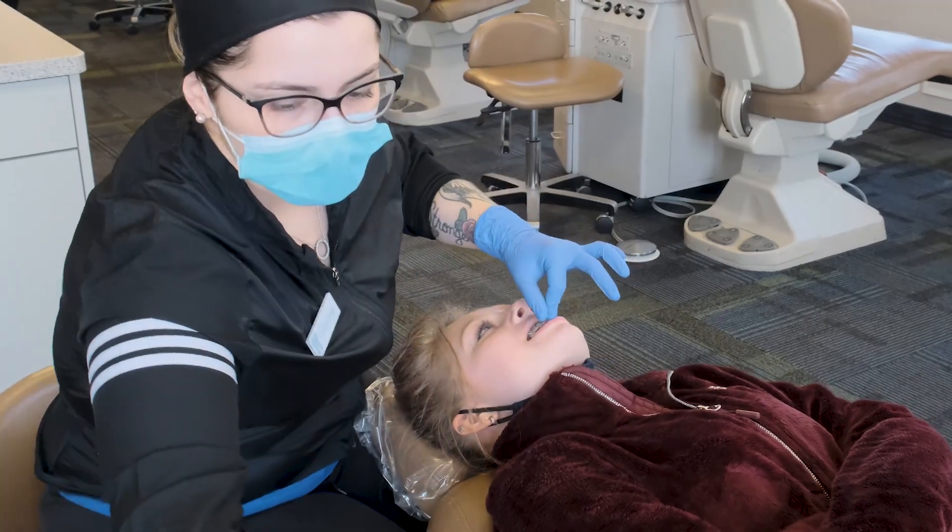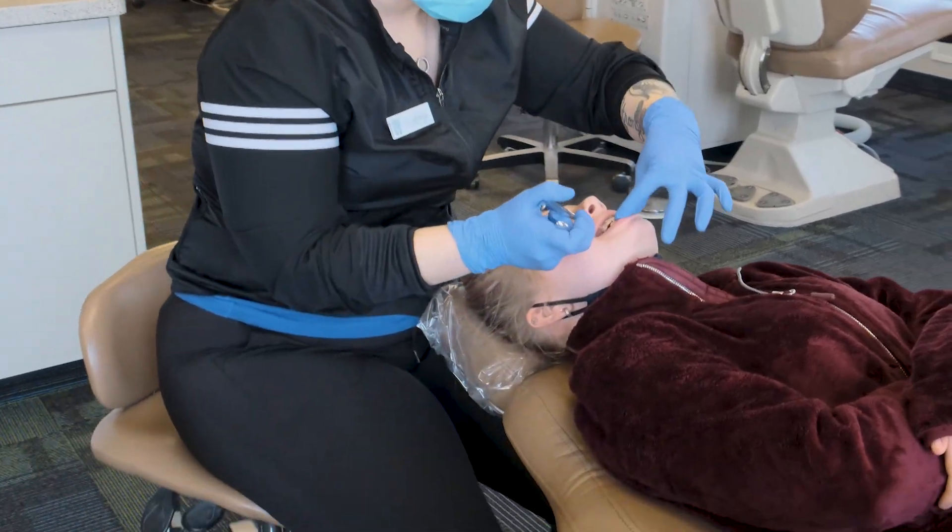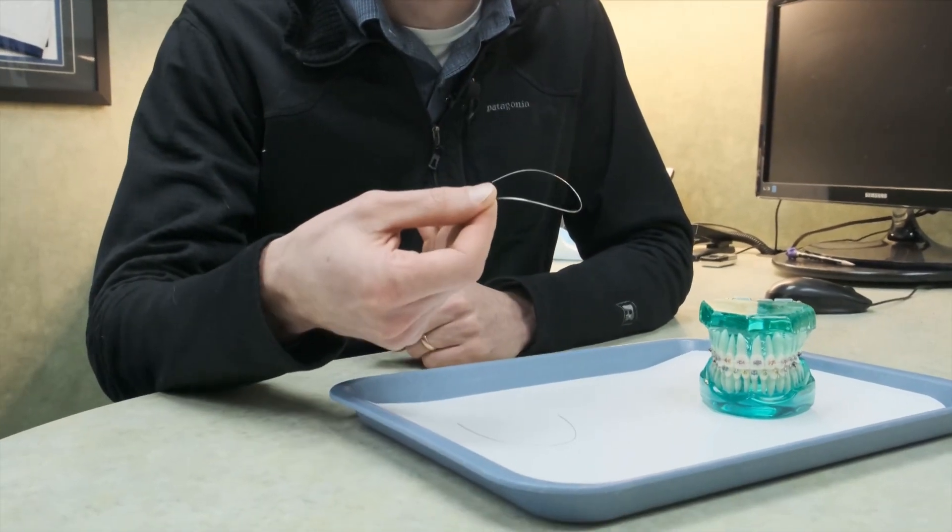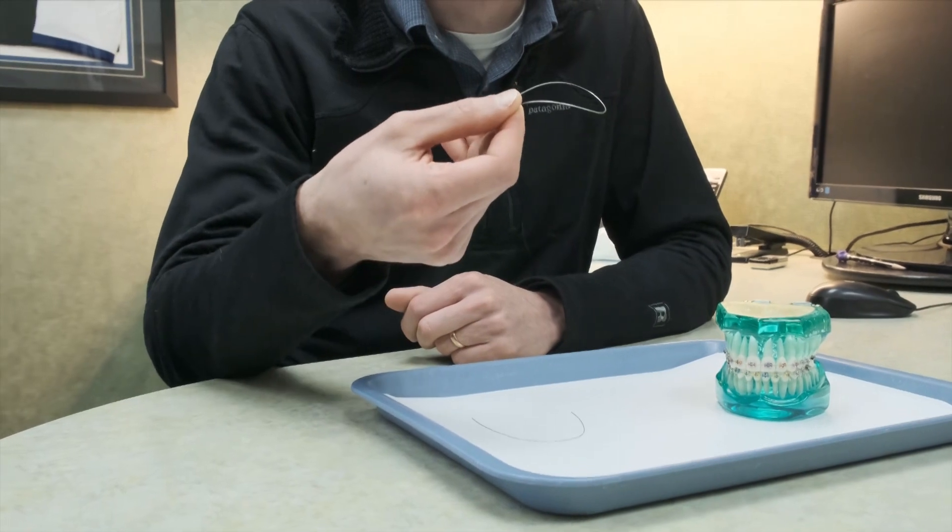Depending on what we're trying to do with treatment, we can put different wires in. This is called a reverse curve wire, and you can see that it's not flat.